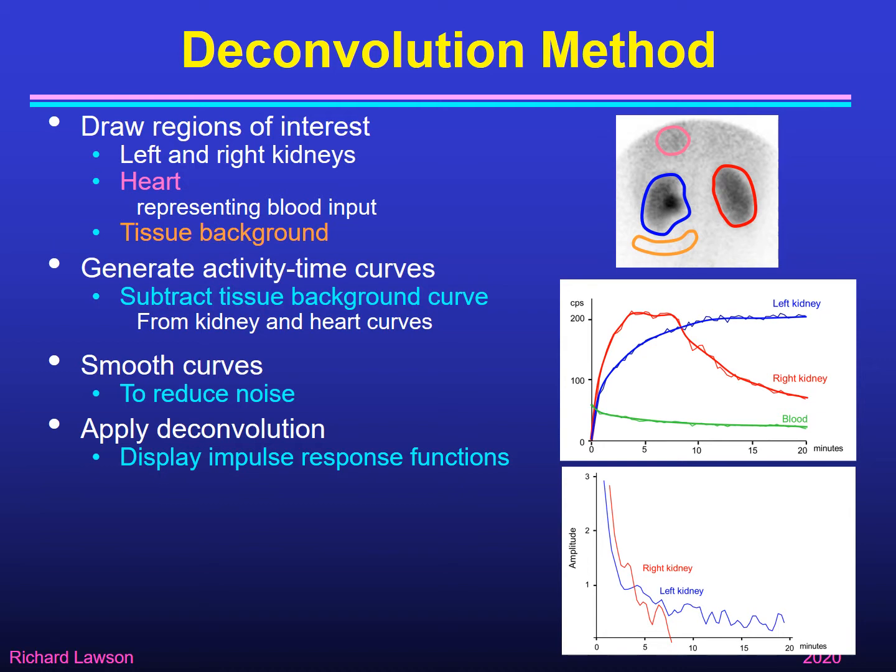Some computer analysis programs will give you the numerical results without actually displaying the curves. But in my experience it's worth displaying the curves, then you can see whether the curves look sensible, and if they are you will be able to have confidence in the result that it gives. But if you don't look at the curves you don't really know whether the numbers make sense or not.